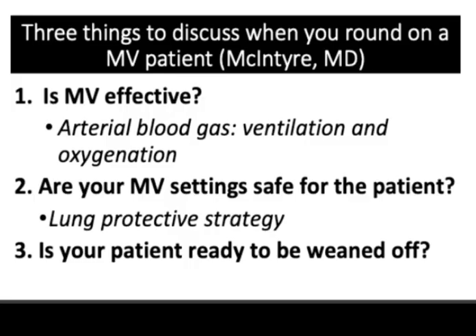One way to approach a patient on mechanical ventilation is to ask yourself three important questions. The first question you want to ask yourself is: is the mechanical ventilation effective? In order to figure this out, you can look at arterial blood gases and determine if your PaCO2 and PaO2 levels are adequate, or at least what you're shooting for. The next question you're going to ask yourself is: are your mechanical ventilator settings safe for this patient? Are you following a lung protective strategy? And the final question is: is your patient ready to be weaned off?